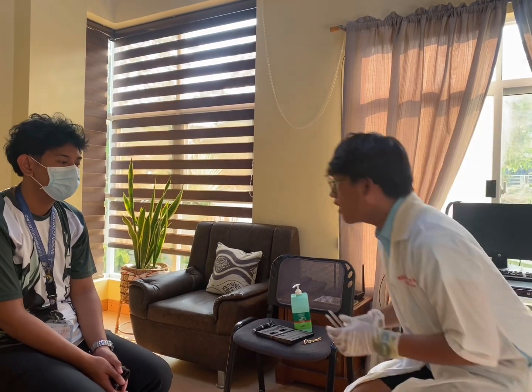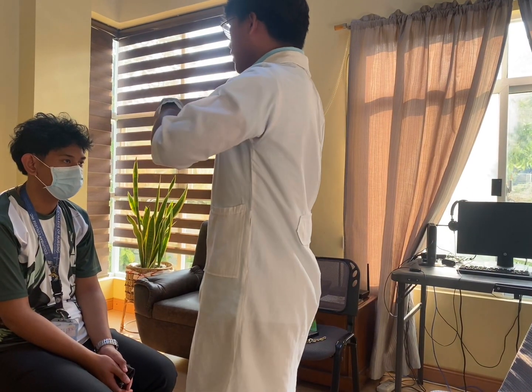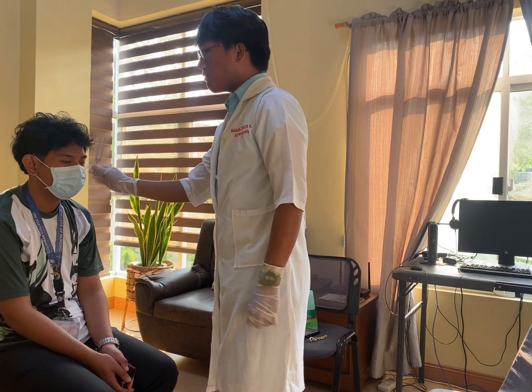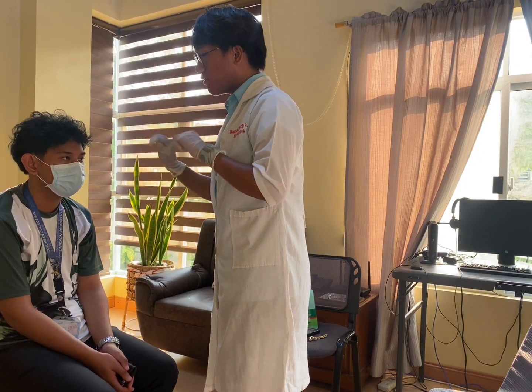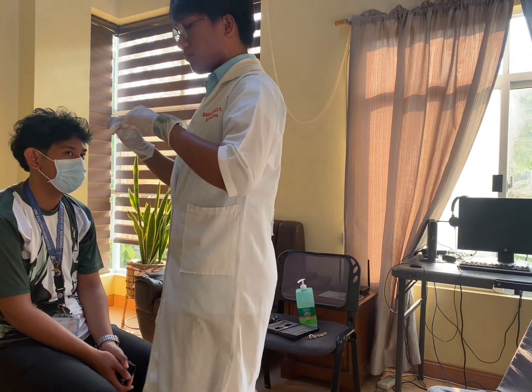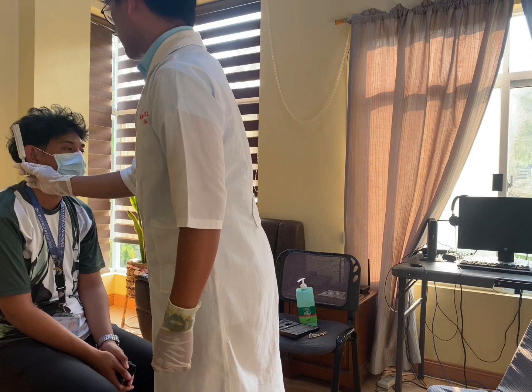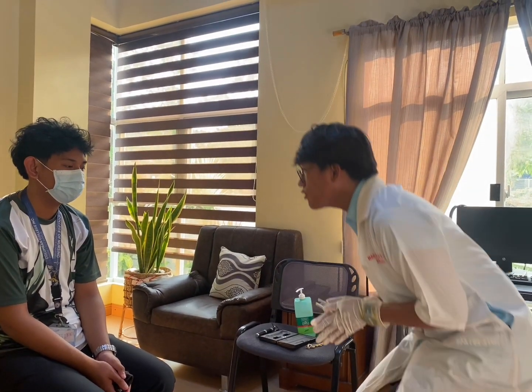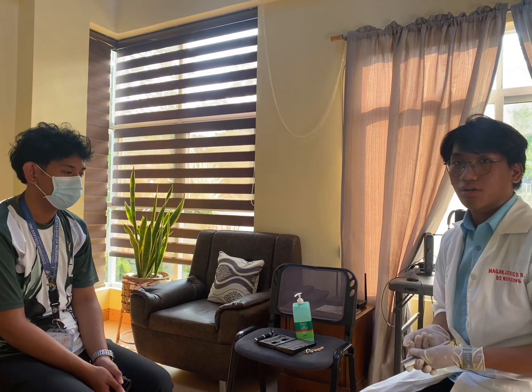Next, I'll be conducting a Rinne test. Using my tuning fork, I'll compare the air and bone conduction. Can you please tell me po kapag nag-stop na po yung vibration? Okay, as I observe, the air conduction is heard longer than the bone conduction po.